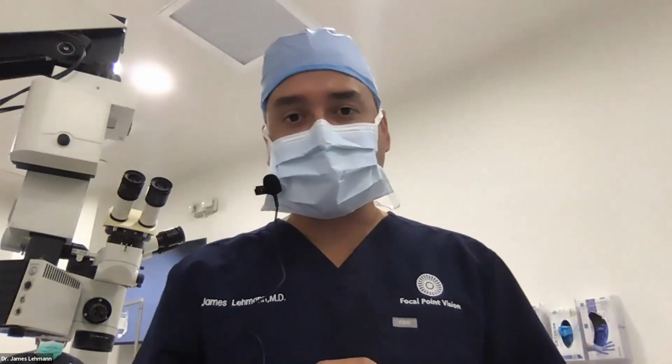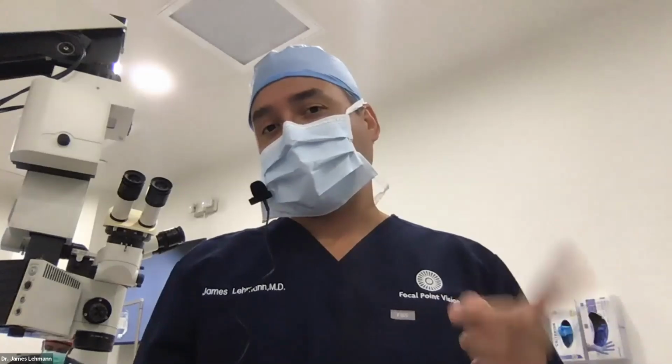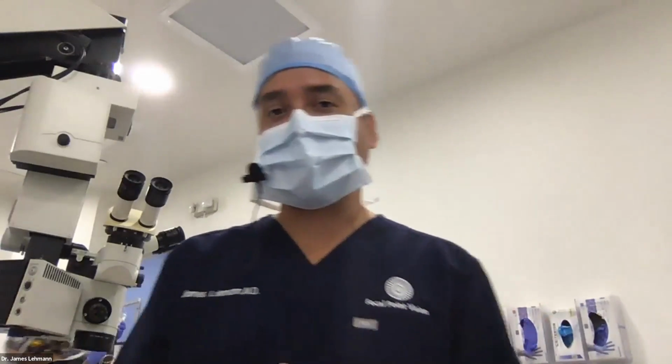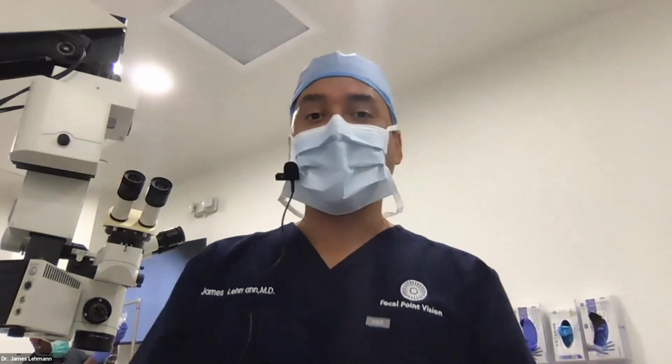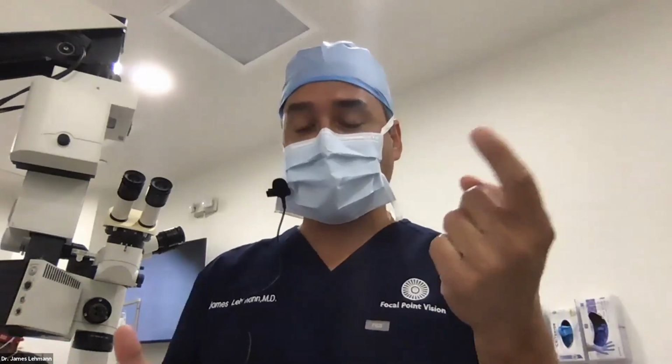How to rotate epinuclear sheet with blunt chopper, by Dr. Devendra. In this situation, I didn't really have an epinucleus. You can make one by doing hydrodelineation in normal phaco, and it can be manipulated. But to me, that's just extra steps. I prefer just doing hydrodissection and not hydrodelineation. If there happens to be an epinuclear sheet, you rotate it pretty much like you rotate a nucleus, basically with some sort of blunt instrument. You go out to the periphery and use torque to help there.